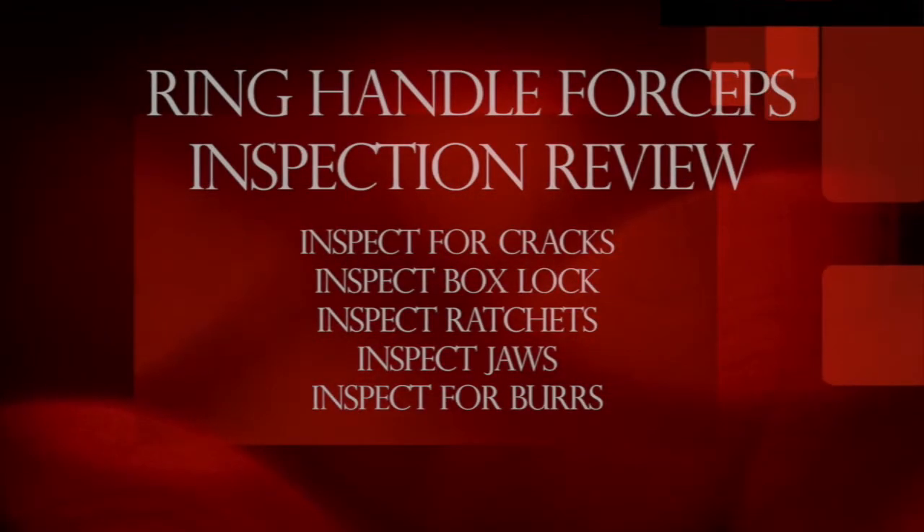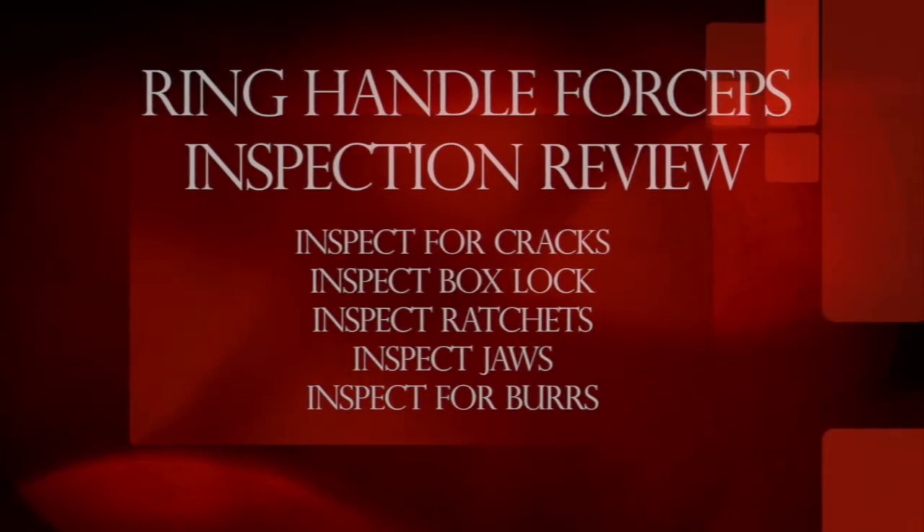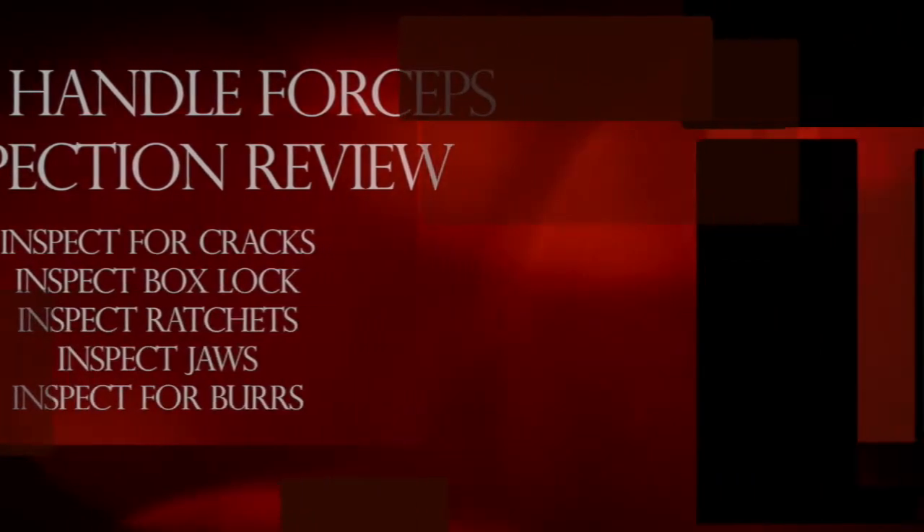Ring-handled forceps inspection review: inspect the instrument for cracks, inspect the box lock, inspect the ratchets, inspect the jaws, and inspect for burrs.